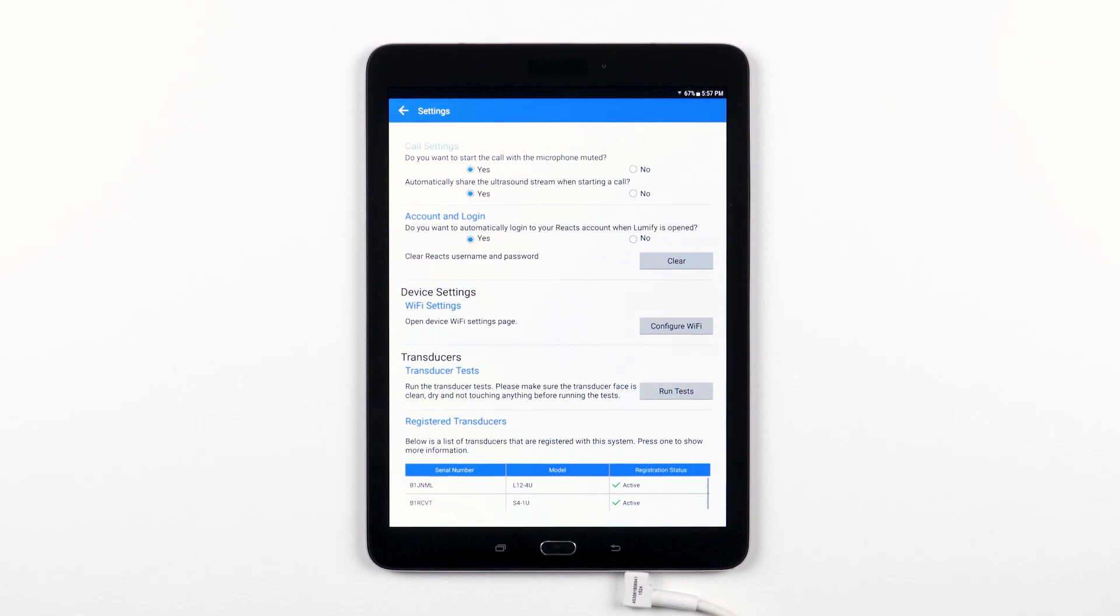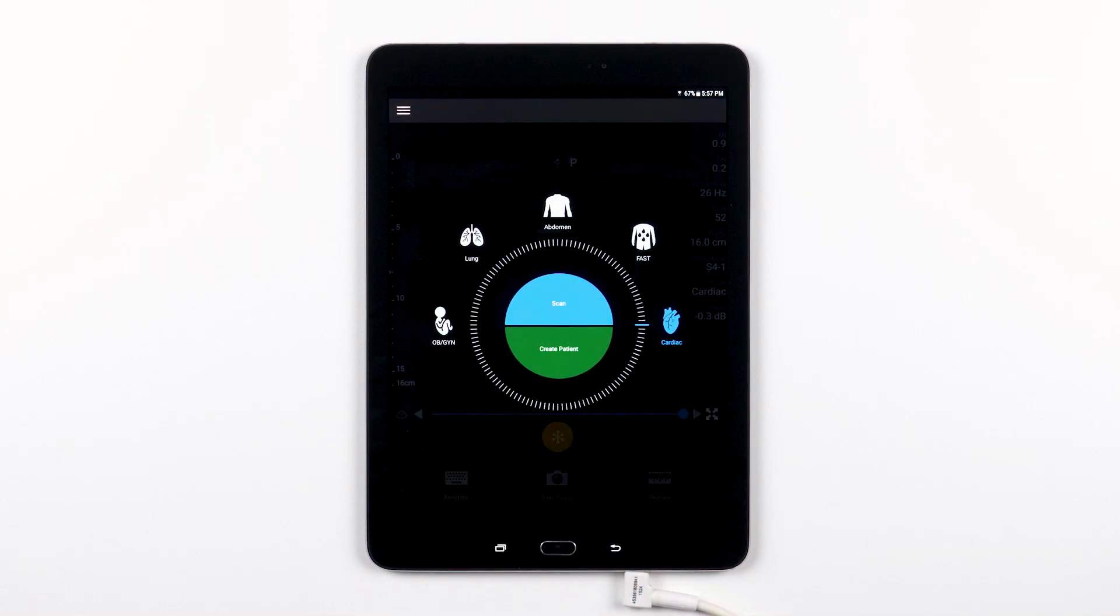Now that you are familiar with what is included in the Lumify settings menu, you know where to go to ensure you are making the most of your Lumify ultrasound system.